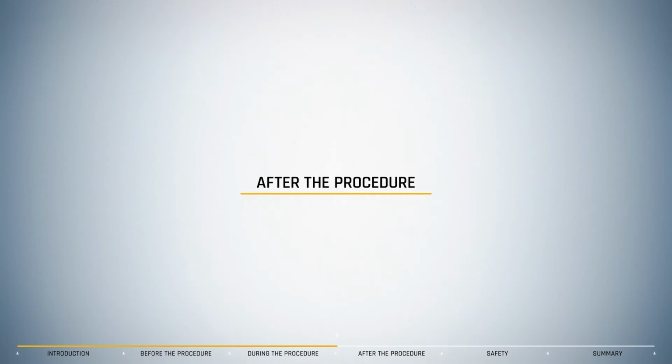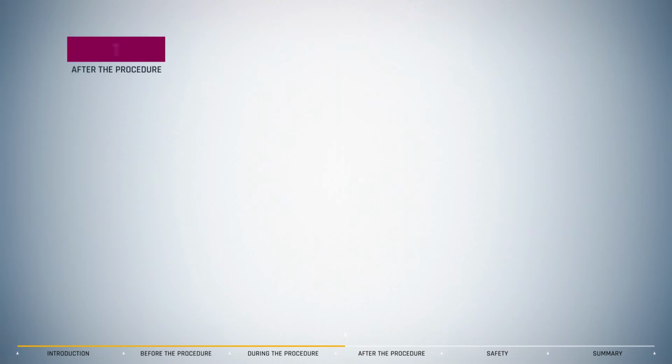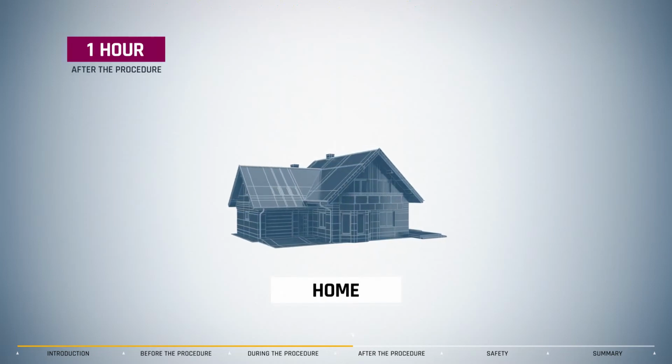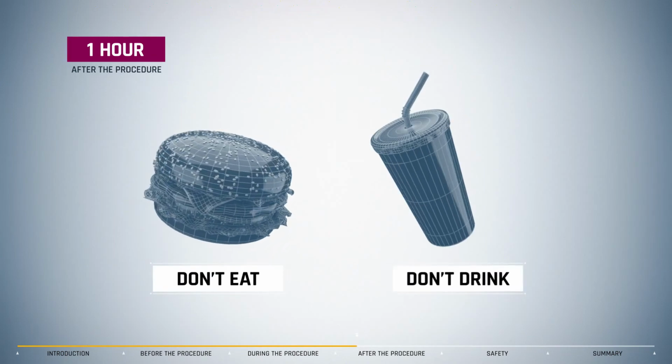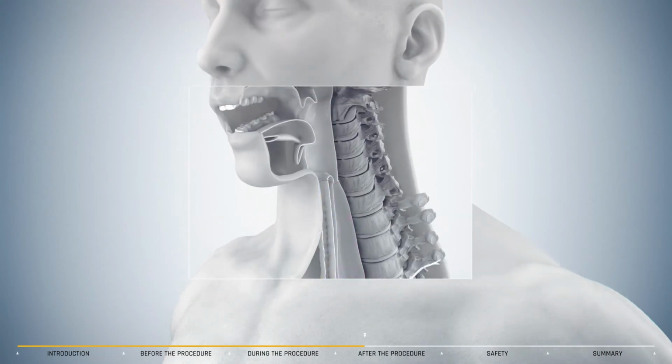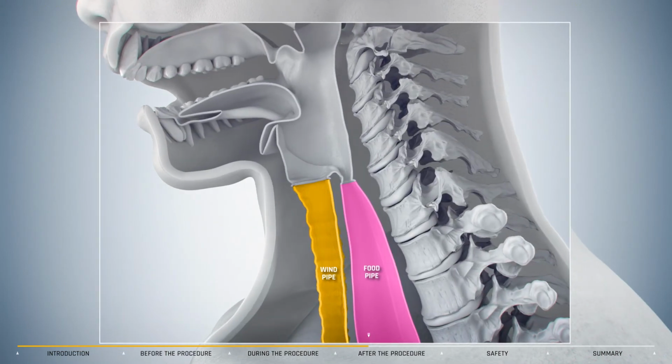EBUS bronchoscopy is an outpatient procedure, so as soon as the sedation has worn off, after about an hour or 2, you will be checked and able to go home. You should not eat or drink for at least 1 hour after the test, because your throat will be numb and you would not know if food or drink went down the wrong way.